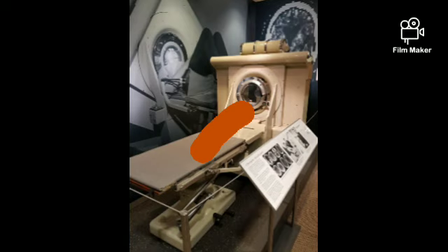In this machine you can see there is a gantry apparatus, and inside you can see a hollow transparent block, and that is known as the water bath. As first generation CT scanning was taking a long time, this specialty was there in this scanner, and it holds the patient and prevents movement. So that was the specialty of our first generation CT scan.